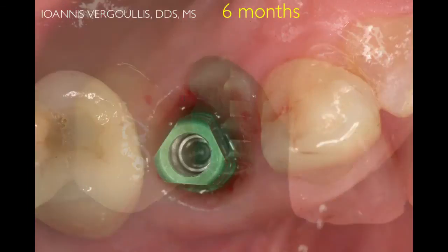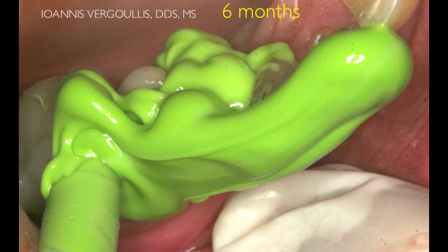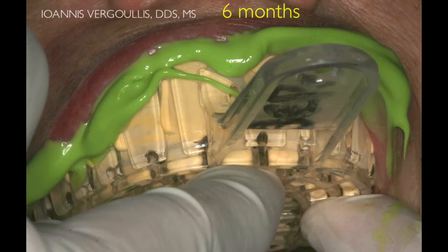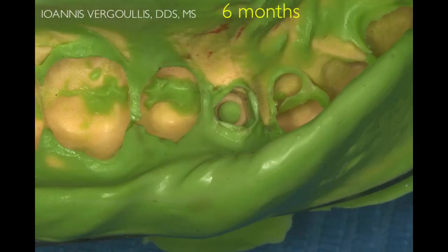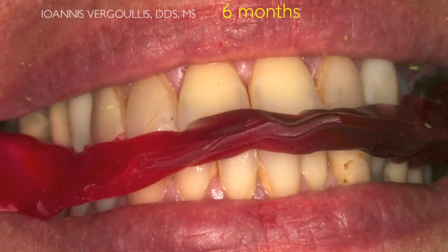We utilize an impression coping in order to take a closed-tray impression utilizing polyvinylsiloxane material. This is the impression, and now we are able to place the impression coping into position, take a bite registration of the patient, and send all this information to the lab in order to fabricate the final crown.